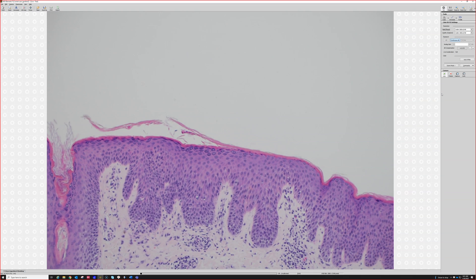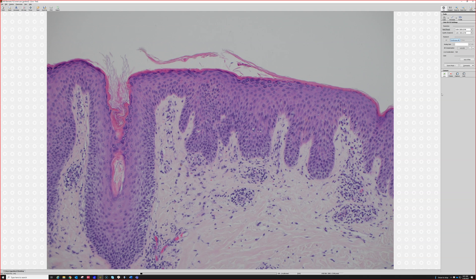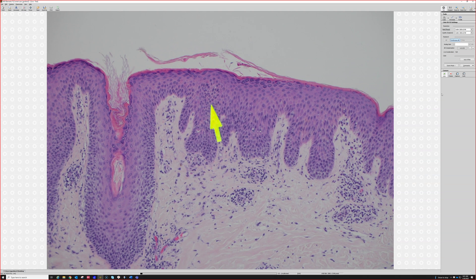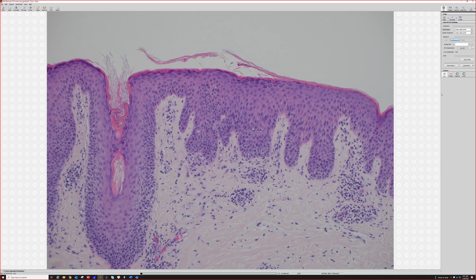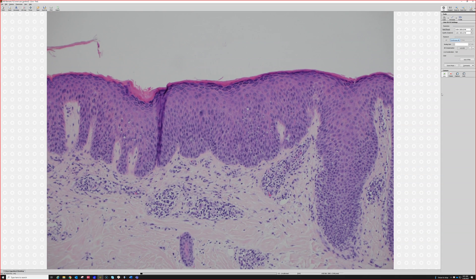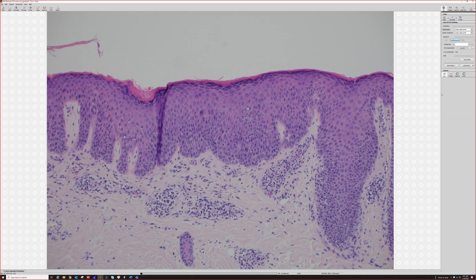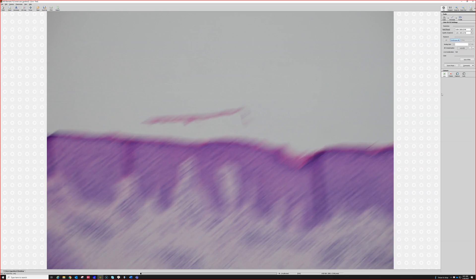We've got a little bit of spongiosis right here, so spongiotic dermatitis. It looks like it's been going on a little while because we've got some hypergranulosis, so it's starting to kind of lichenify. The epidermis is getting thickened and acanthotic. That acanthotic epidermis and hypergranulosis are both signs of chronicity.